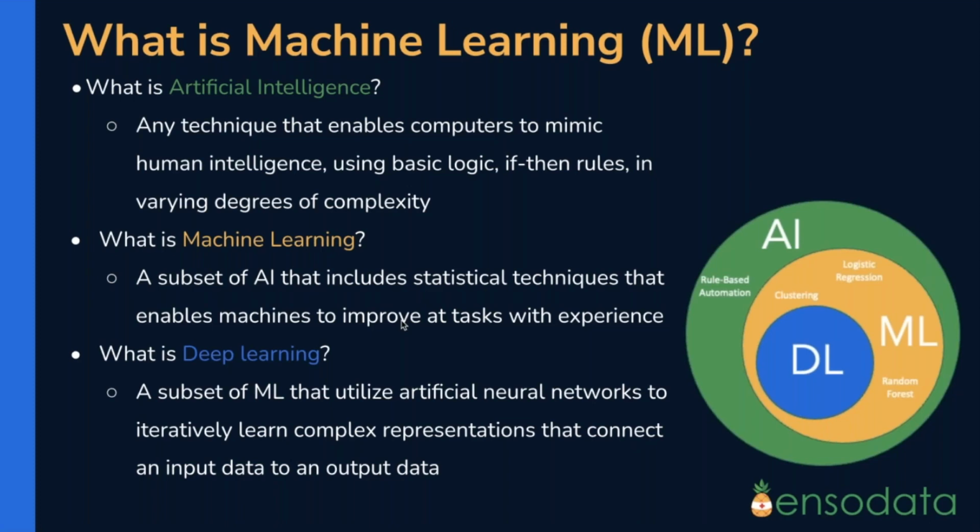What's unique about them is that they leverage something called artificial neural networks that are inspired by the neural networks that we have in our brains. And what's unique about these models is that they can leverage a huge amount of data to learn even more complex representations of our input data, much more complex than the representations of those more classical machine learning approaches. What these models can do is extract both low-resolution and high-resolution features in order to perform some sort of task.